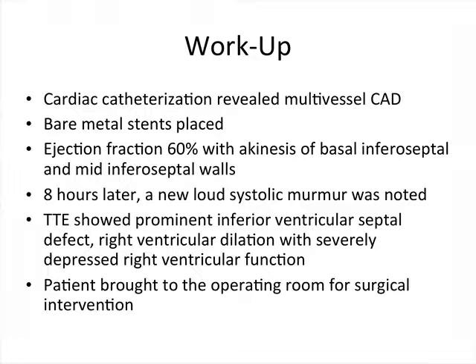He had bare metal stents placed in all of these arteries and was sent to the intensive care unit with a thorough revascularization. 8 hours later, however, a new loud systolic murmur was noted, and transthoracic echocardiography showed a prominent ventricular septal defect in the inferior portion of his interventricular septum, with right ventricular dilation and severely depressed right ventricular function. He was emergently brought to the operating room for surgical repair of his ventricular septal defect.